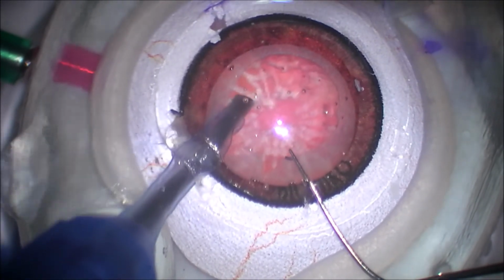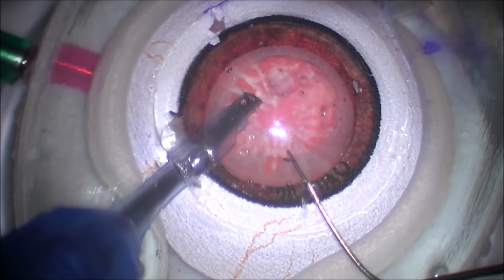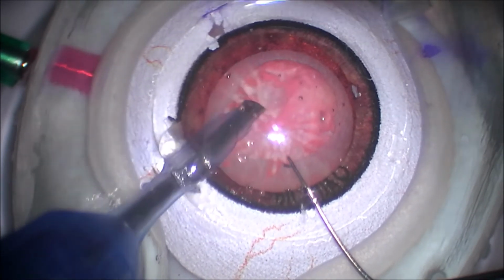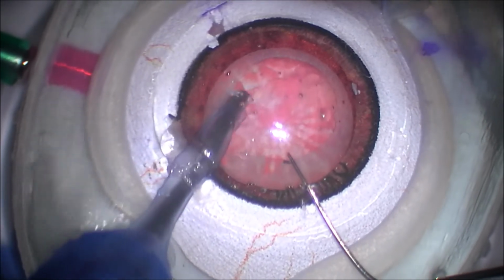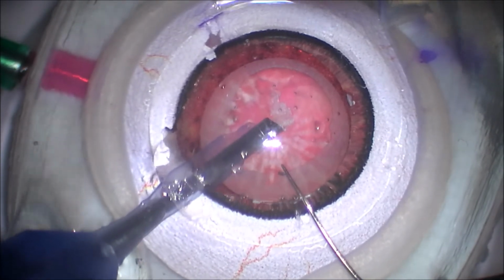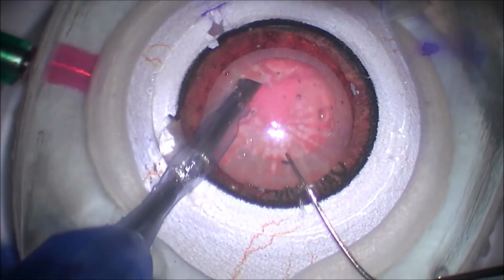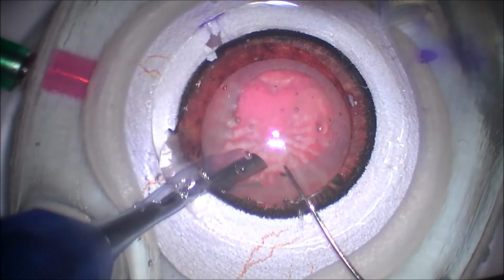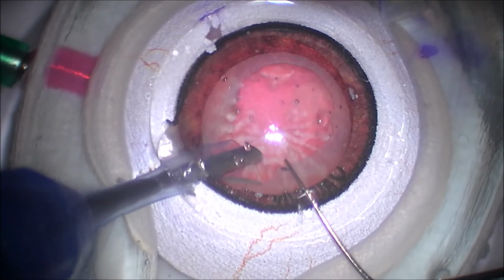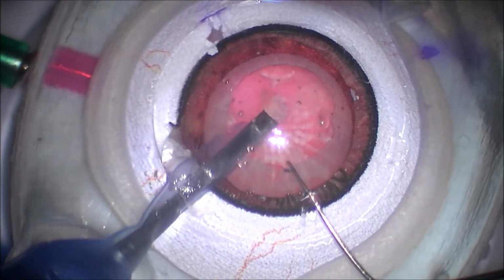So you can see here, she's trying to grab that piece. She's trying to get purchase of it and then grabbing it up. Again, not so easy, but the lens is just crumbling as she's chipping away at these pieces. And she's patiently teasing off these pieces one by one. So essentially, she's removed about half of the lens pieces contra-incisionally. She still has some sub-incisional lens pieces. And again, using aspiration and vacuum, she's chipping away at these lens pieces, and she's being very mindful of not getting that phaco tip near the posterior capsule.